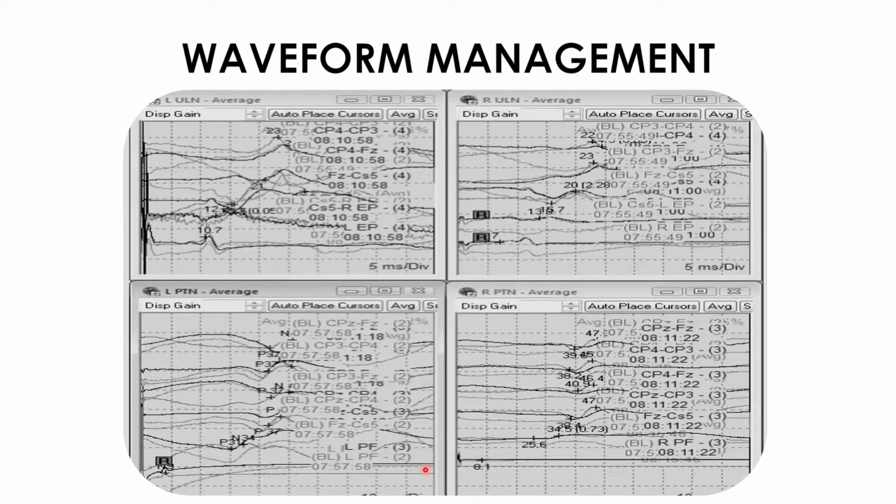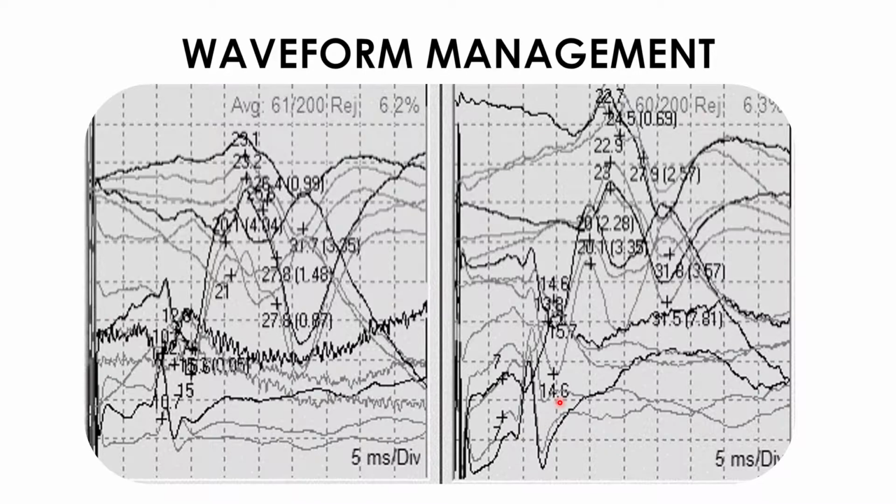Lastly, in the SSEP module, I wanted to talk about waveform management. This is one of my pet peeves. I recently took on a job, in the last few years, as a remote technical supervisor. My job is to help newer technologists out in the field when they go on their own. When I see something like this, it kind of drives me crazy. It gets my OCD acting up. You need to organize these labels so that they're not in the way and they're not obscuring your data. Adjust your gains so that you can actually see the data channel by channel.